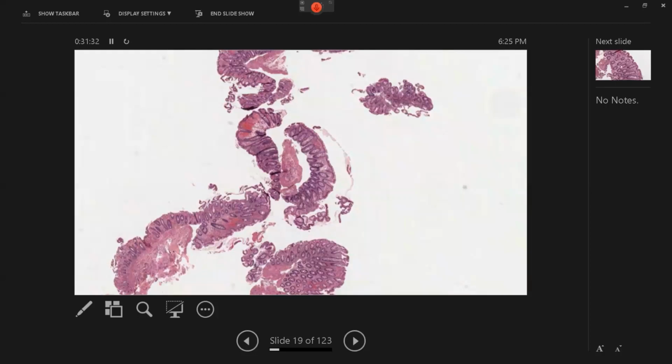And then we're still in the search for some other clues. And I just wanted to highlight that, yes, sometimes I don't give you the full pictures on the low power. Of course, I am limited in the length when I take a picture. But I just want you to, even at low power, realize if you have heterogeneity in your biopsies or not, okay?